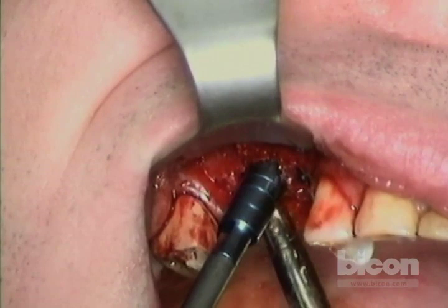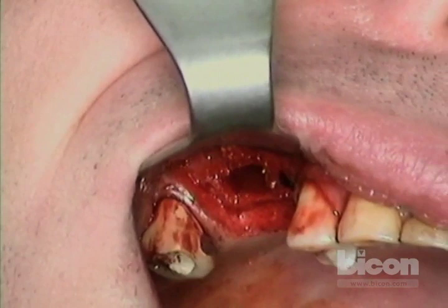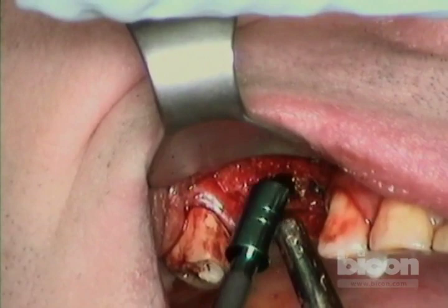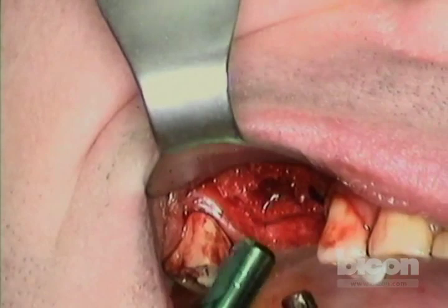That's pretty tight, which is exactly what I want. I'll take the six-millimeter hand reamer and then a six-millimeter dilator. Switching between hand reamers and site dilators — there's no real rule. You do what you feel the bone needs: sometimes cut a little bit, sometimes a combination of cutting and expansion. In this case, I just needed to cut a little bit on top and then expand the rest. I'll take a 6 by 5.7.